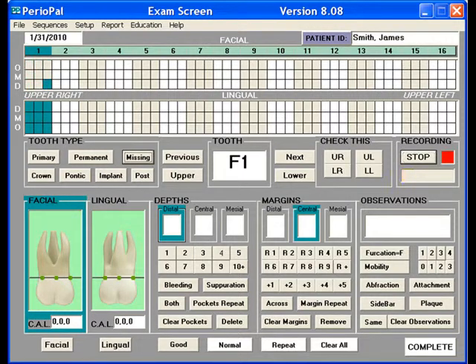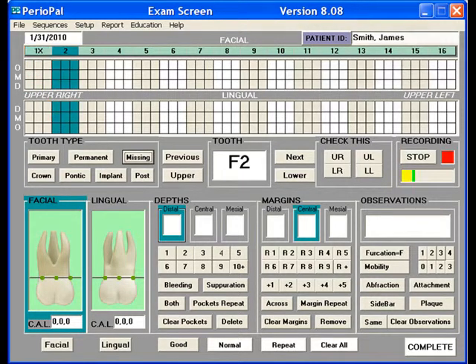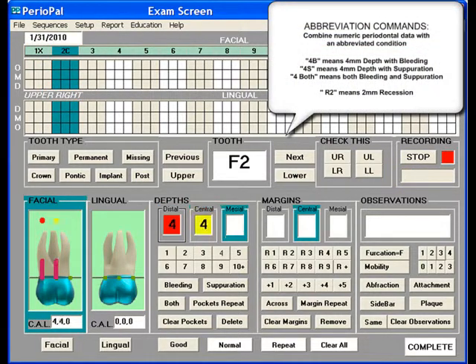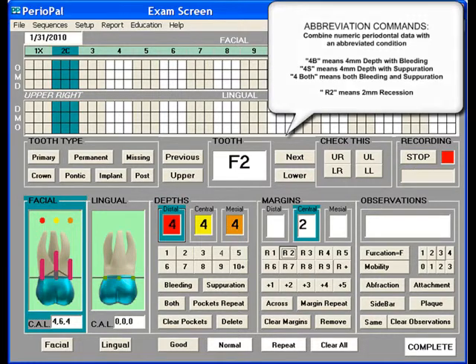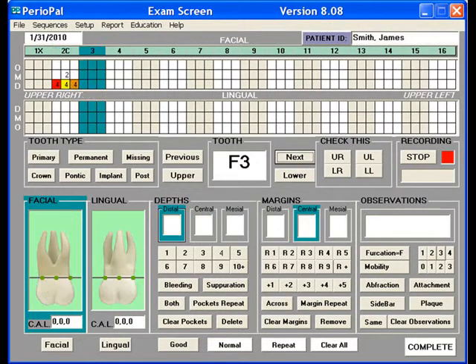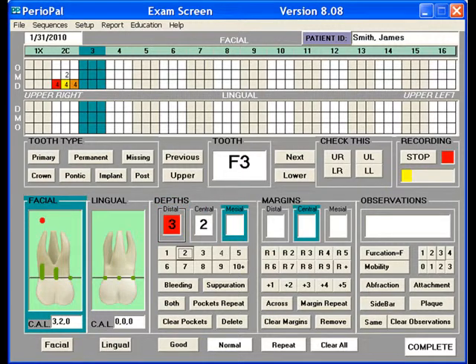Missing. Crown. 4B, 4S, 4 both. R2. Next. 3B, 2, 4B, R2.